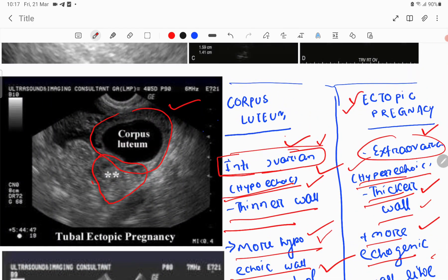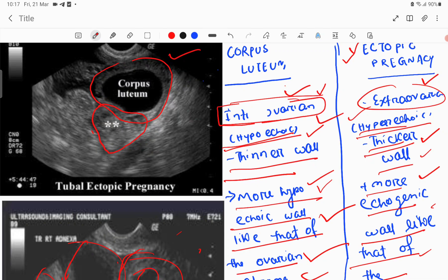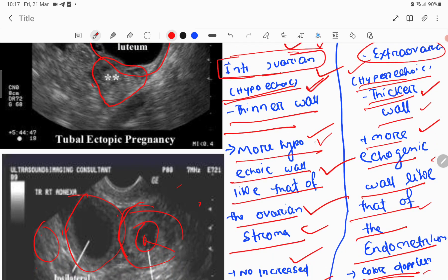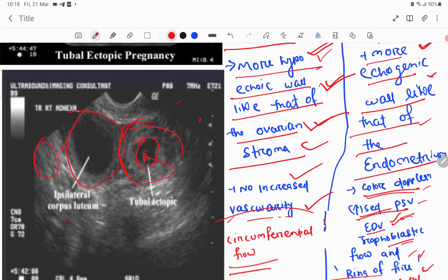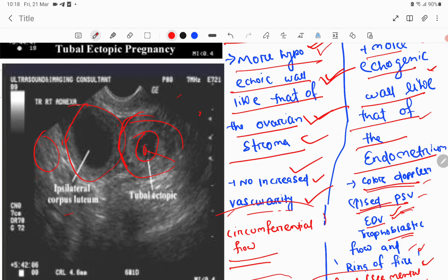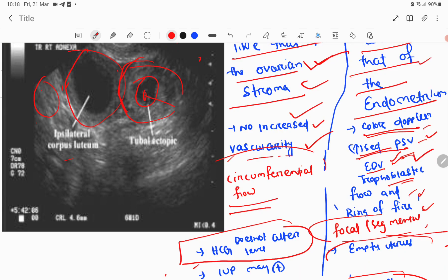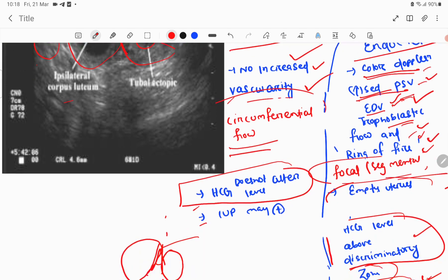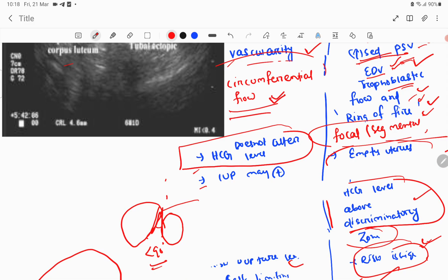To recap: corpus luteum has intra-ovarian origin; ectopic pregnancy has extra-ovarian origin. Corpus luteum has a thinner, hypoechoic wall similar to ovarian stroma. Ectopic pregnancy has a hyperechoic, thicker wall similar to endometrial lining. Corpus luteum has no increased vascularity; ectopic pregnancy shows increased color Doppler signal with elevated peak systolic and end-diastolic velocity, trophoblastic flow, and ring of fire sign. Flow is circumferential in corpus luteum and focal/segmental in ectopic pregnancy.